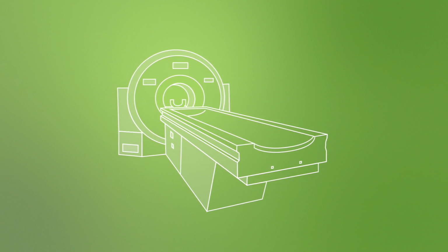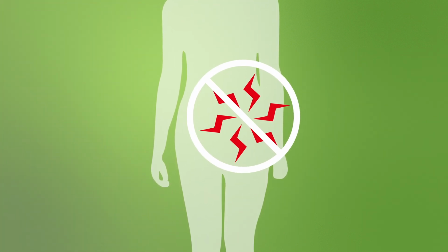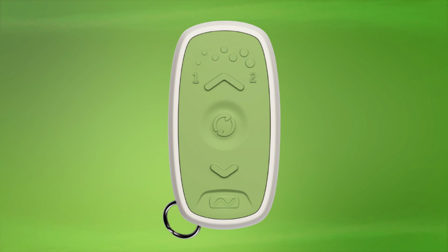The type of scanner and length of the scan will vary depending on what your doctor requested. You should not feel any irregular discomfort or pain at your implant during the scan. If you do, let the MRI technologist know immediately. Once your MRI scan is complete, be sure to turn your therapy back on using your remote control so you can continue to experience symptom relief.